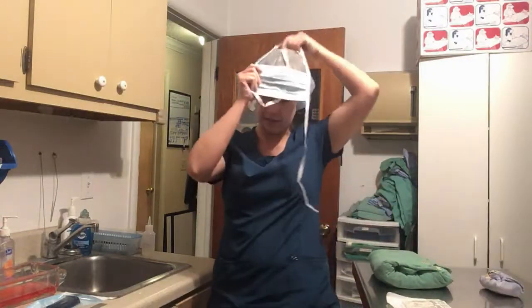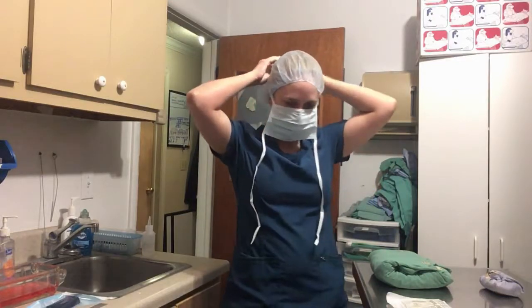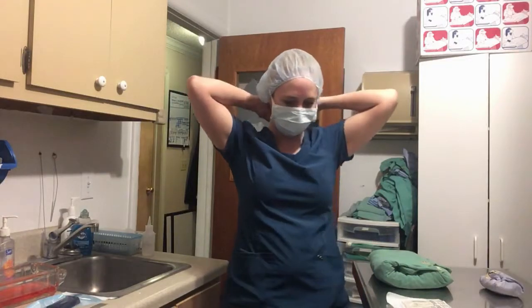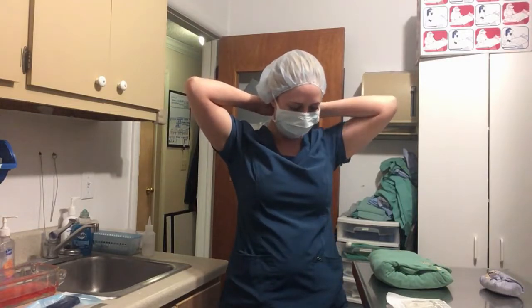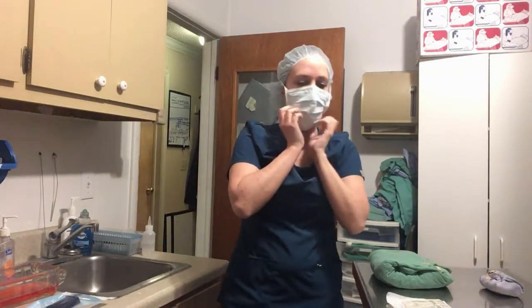Then you're going to go ahead and take your mask. Now that that's done, you don't have to worry about that again.